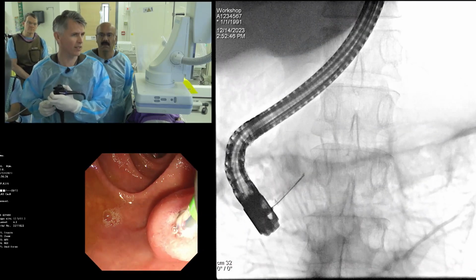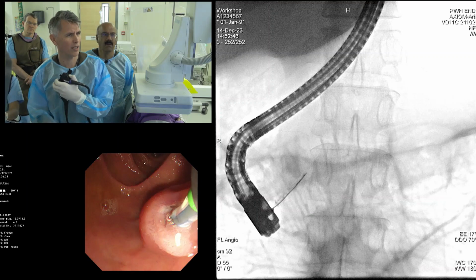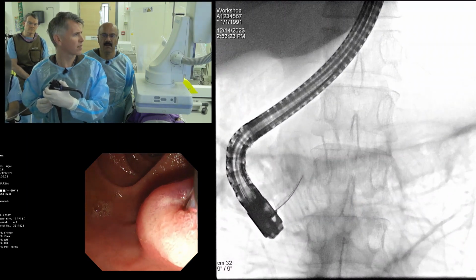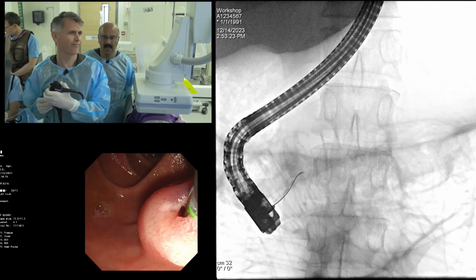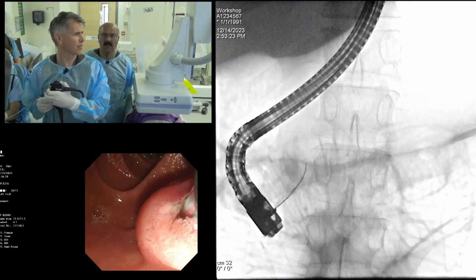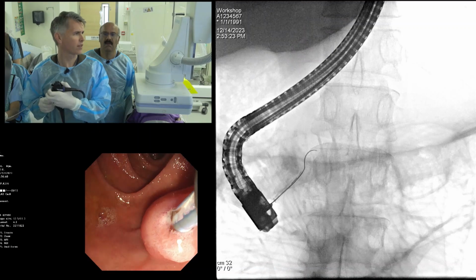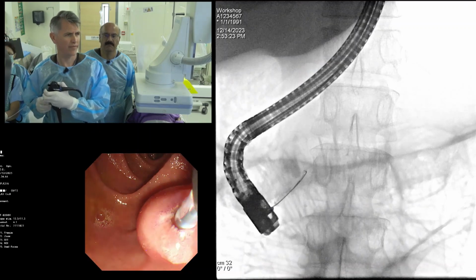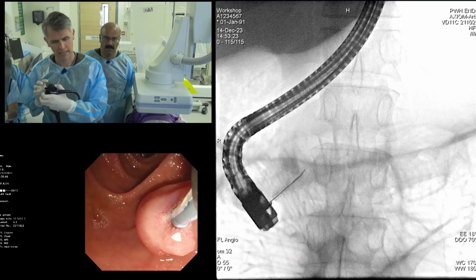That's not easy right now. No. So I just go back a little bit. Professor Beyna, some people would advocate to use ESWL before the ERCP. Definitely. What would you think? Would you like to go for direct pancreatogram and stone extraction, or just do the ESWL before the ERCP?